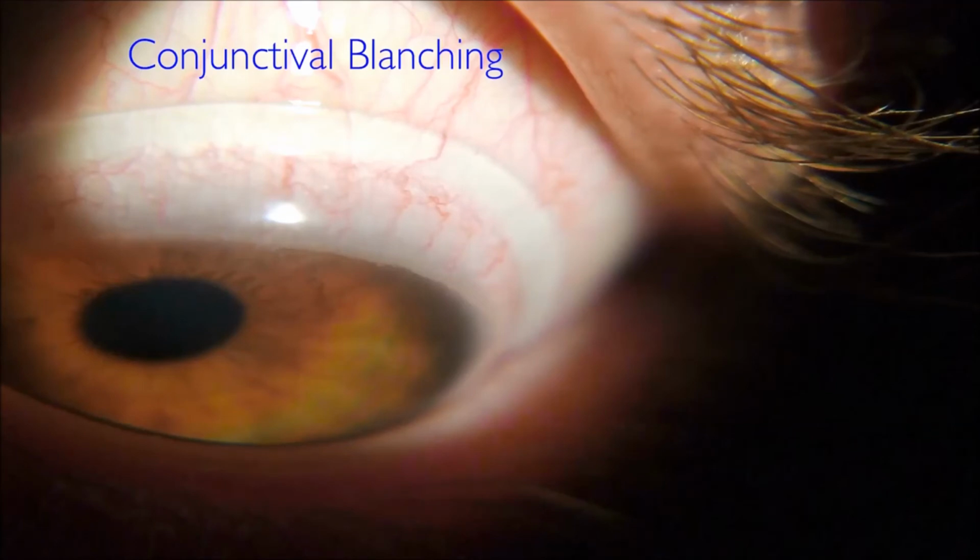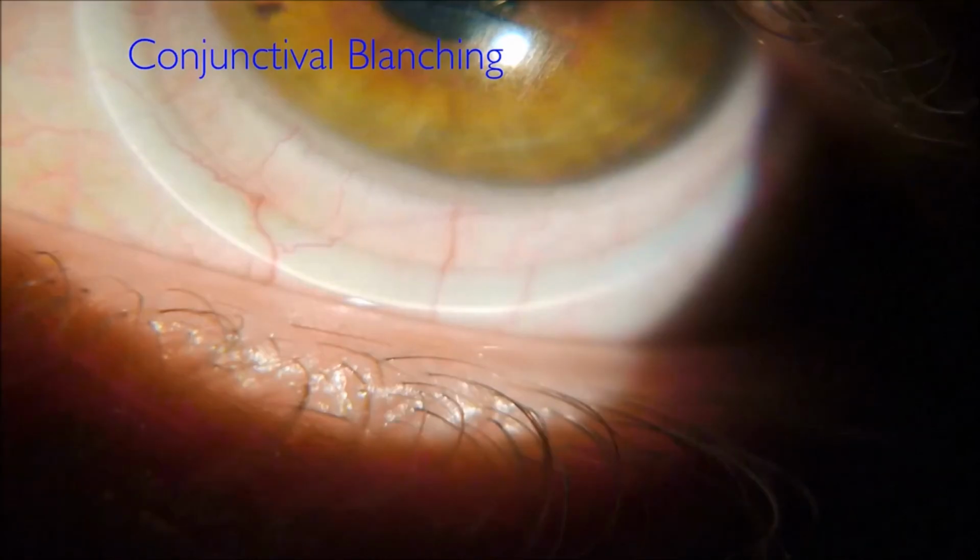Also, when the patient looks down with the lid pushing against the eye, you can get gaze-induced blanching. So what I do is I have the patient look in primary gaze and I see, is this staying the same? If it's staying the same, and if it's the same 5 minutes from now, that is unacceptable blanching. As is this. Notice the bright band. You can also notice that we're getting a little fullness underneath between the limbus and where that area of blanching is. Now that may be an illusion because we've created such a bright white area on the sclera. But that is an area that is too tight.